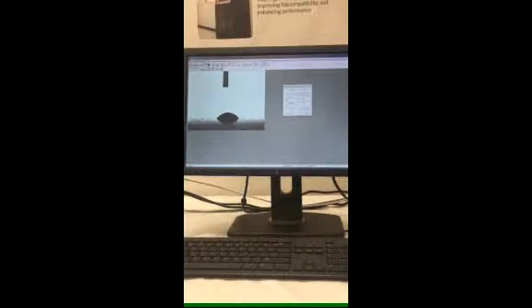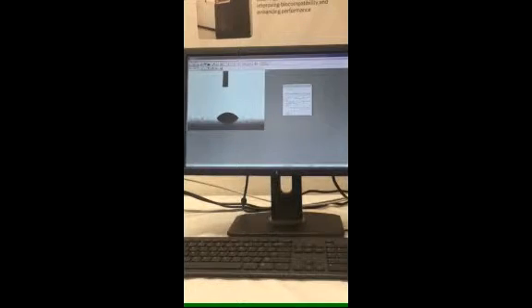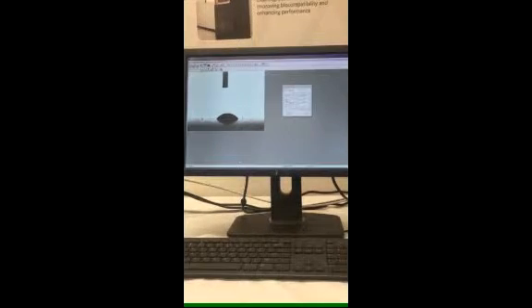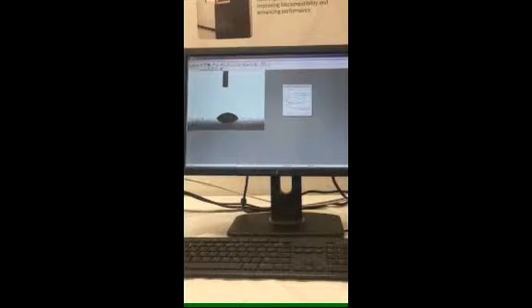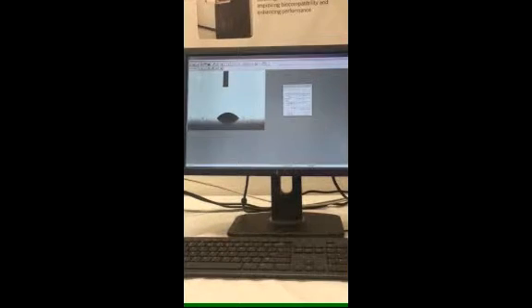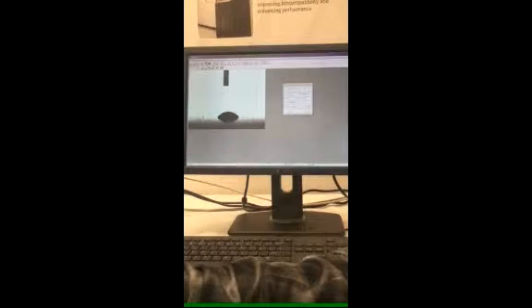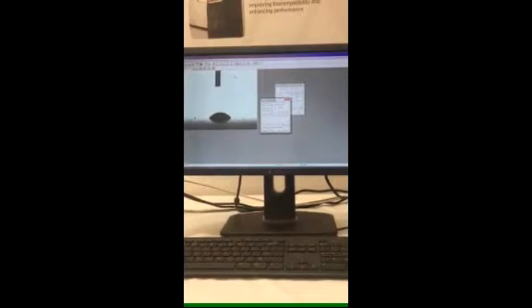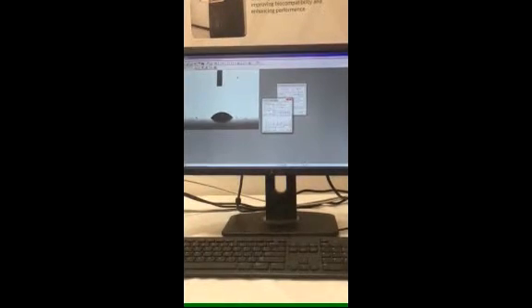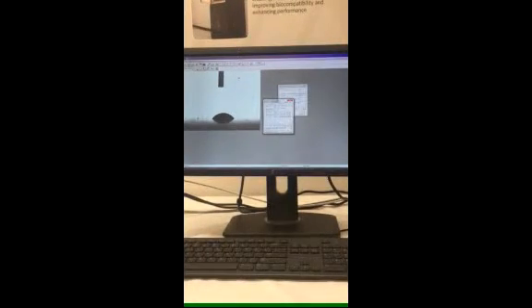Below the arrow controls to the left, you have the delay time before the dynamic image capture. To use this feature, you first have to open the dynamic image capture. Once it's open, you can set the desired delay time. Here, we have set it to five seconds.